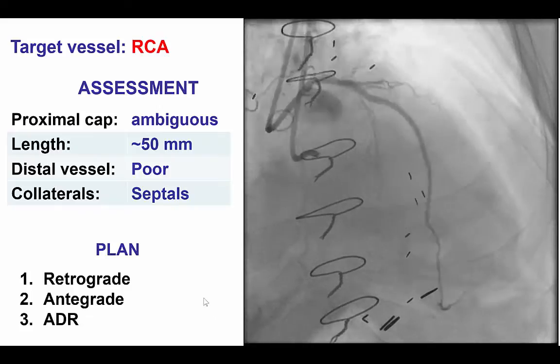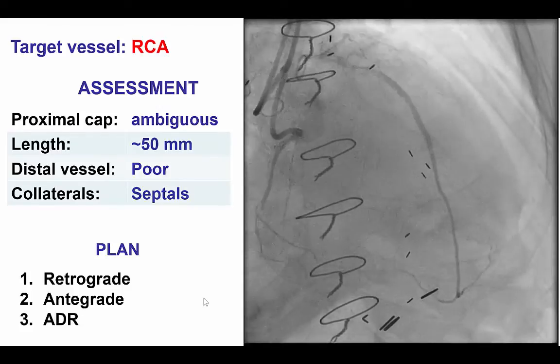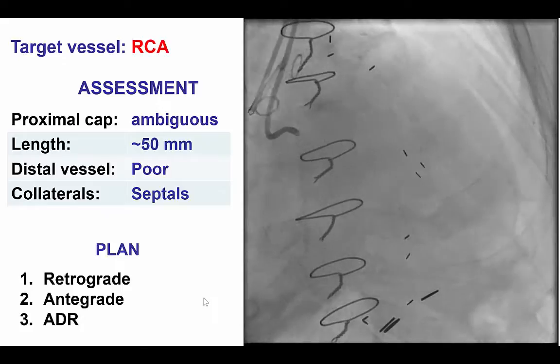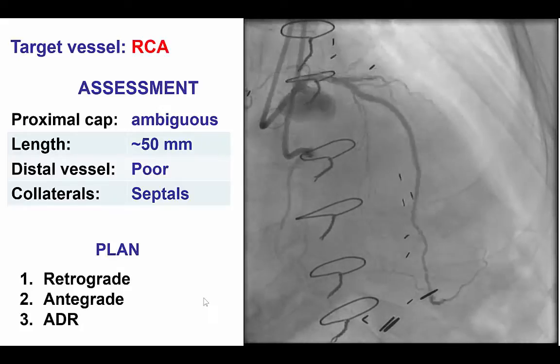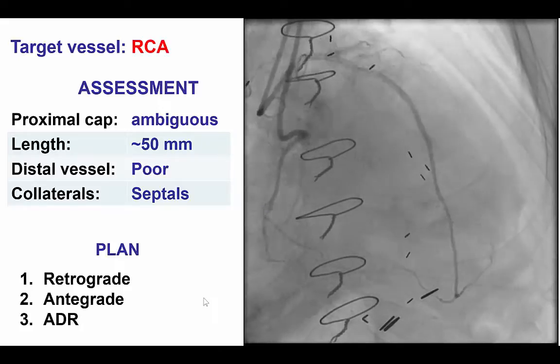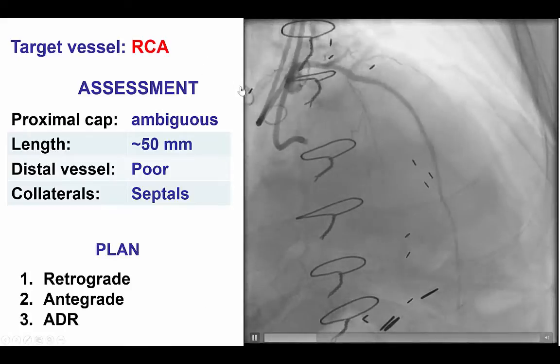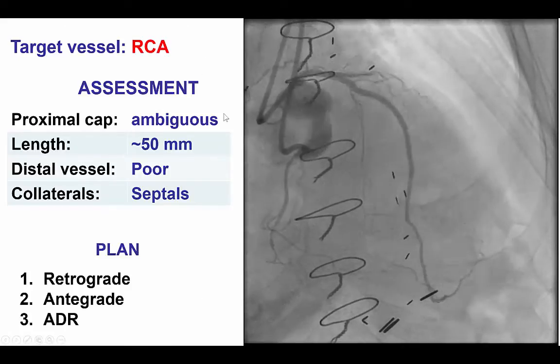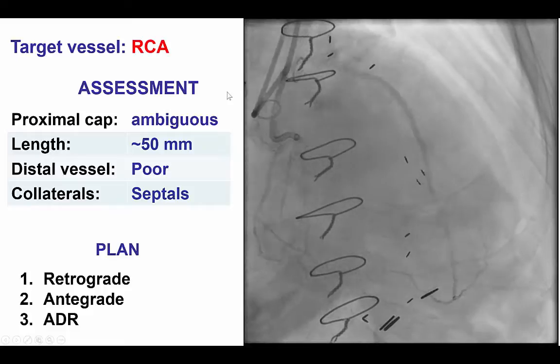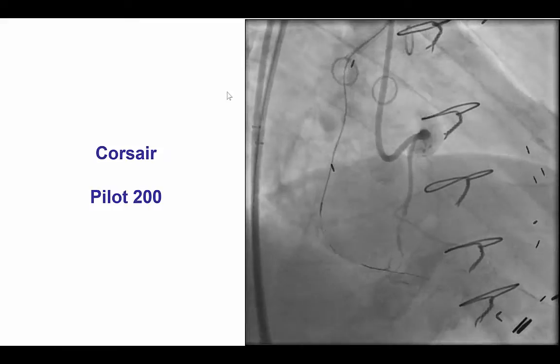In cases like this with an ambiguous proximal cap and small diffusely diseased vessel, the retrograde approach can be an attractive first approach if there are good collaterals. Here it was unclear where the septals would work; however, he did have an occluded vein graft with a proximal beak that could potentially be used, and that was our initial choice.